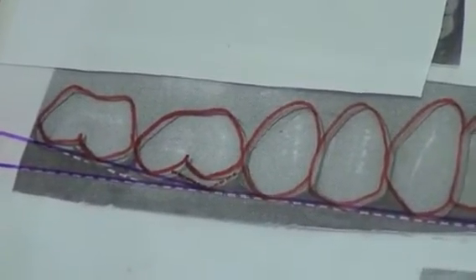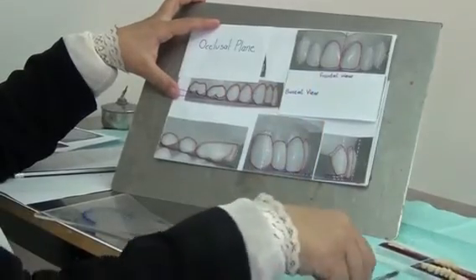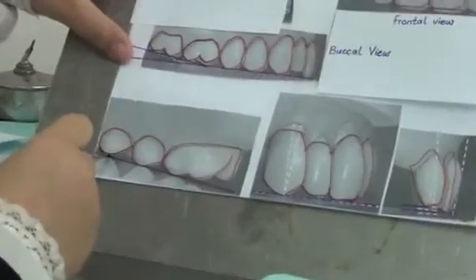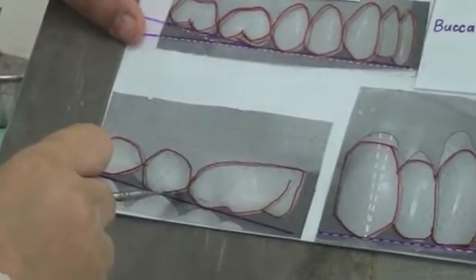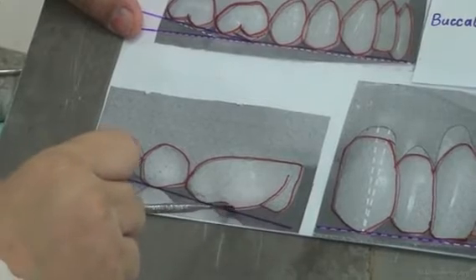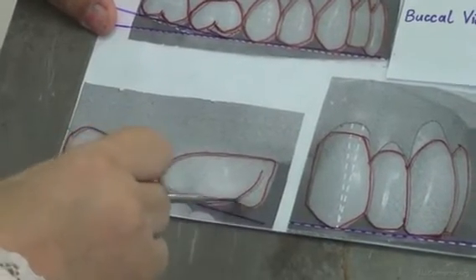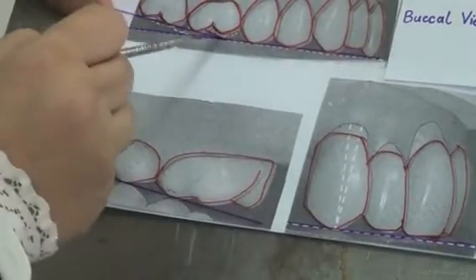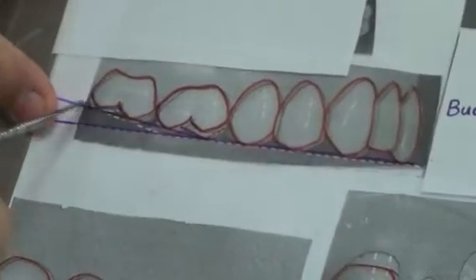If we look from the inside, we're looking from the back. If I'm looking from this side on the occlusal plane, looking from the inside, I should see the first premolar not touching the glass slab. The second premolar palatal cusp is touching. For the 6, the only cusp touching is the mesiopalatal. The distal cusps are higher in occlusion to create what we call the curve of Spee. So the curve of Spee begins from tooth number 6. The mesiopalatal is touching. We go up and up and up to the 7.